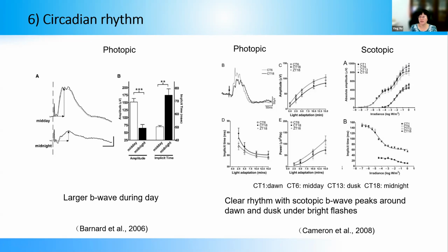So again, what does it mean? It means that when you compare recordings from a series of animals, like more than eight or ten, during one experiment, you really want to get all the data done within a day. You don't want the experiment to last from day to night, since you may expect a smaller response for animals recorded at night. So design the experiment well, so you can finish all recordings either during daytime or during night.